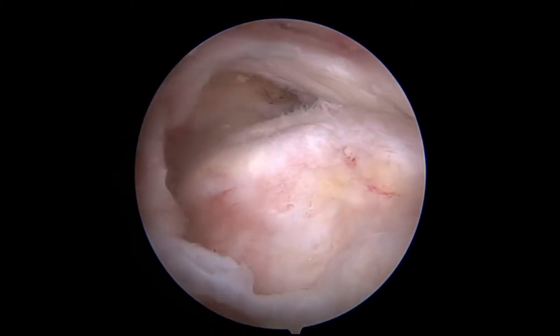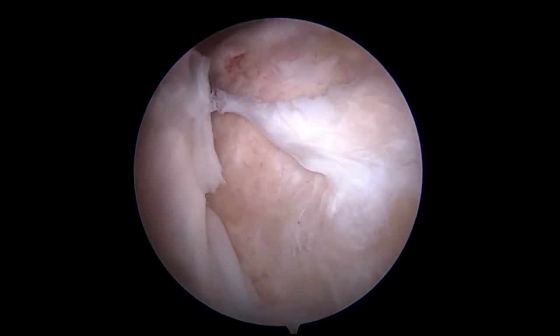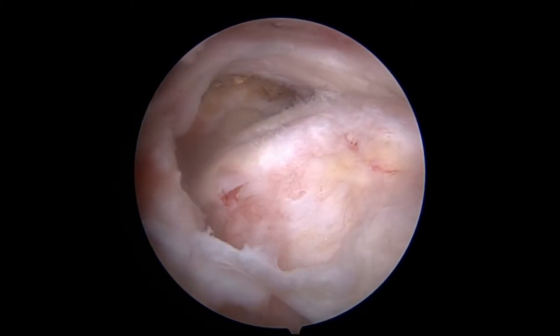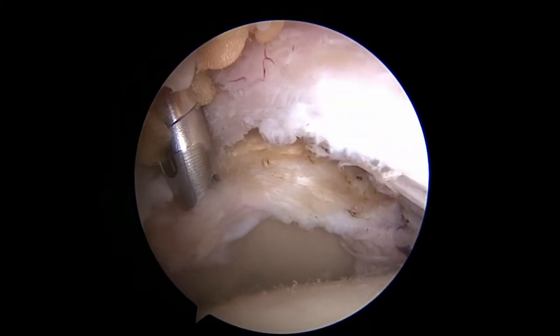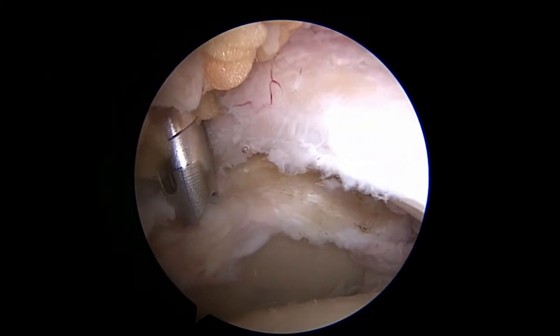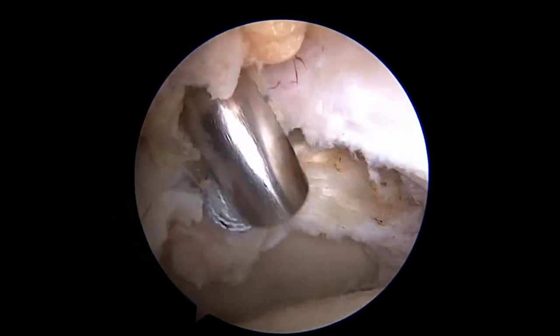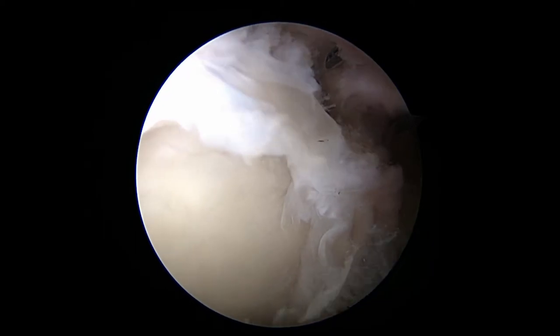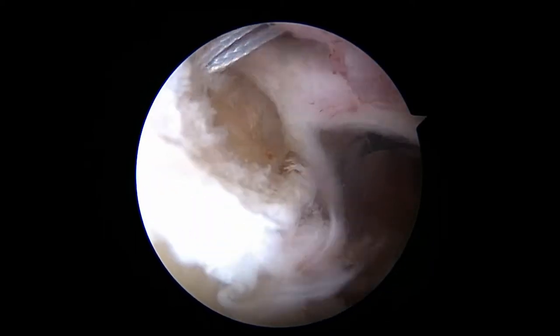The superior capsular reconstruction is for massive irreparable rotator cuff tears with minimal to no arthritis and a fully functioning deltoid muscle. With the arthroscope through the lateral portal, the Neviaser portal is created. A 3.0 millimeter biocomposite SutureTak anchor is placed percutaneously medial to the labrum and posterior. An anterosuperior portal is created and a second SutureTak is placed anteriorly.